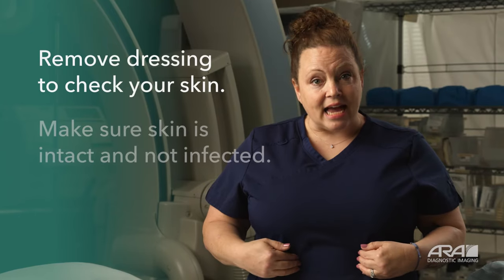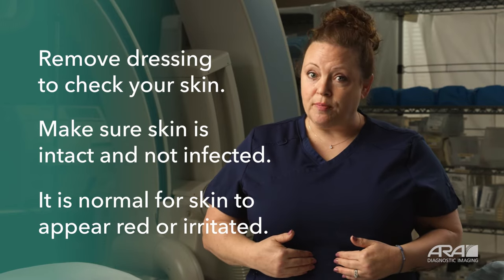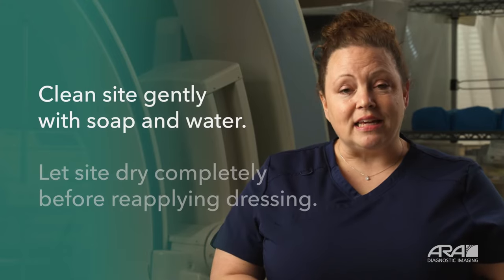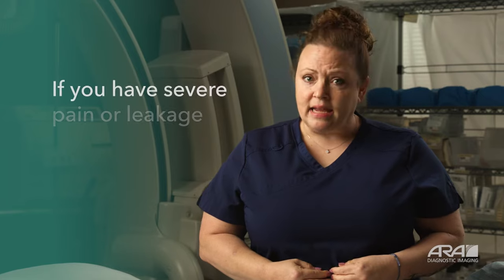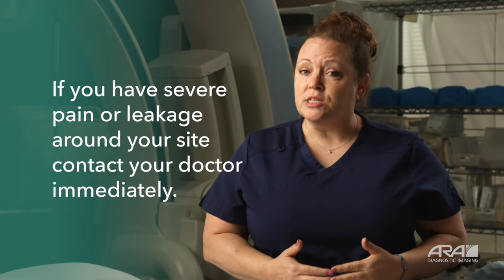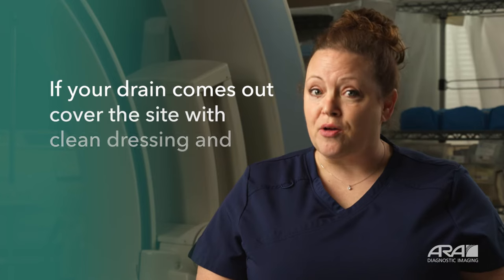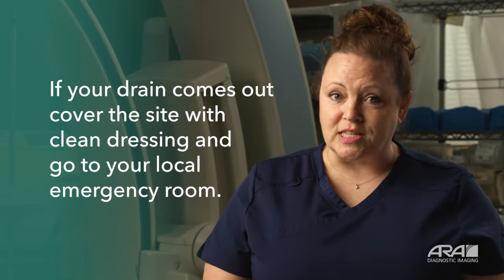When you remove your dressing, take a second and look at the skin underneath. Make sure your skin is intact. It's normal for it to appear a little abnormal. You may have to clean that site. Let the site dry completely before you recover and bandage your site. If you have severe pain or you notice leakage around the drain insertion site, please contact your doctor immediately. If for some reason your drain has come out, cover your drain with your bandaging materials and go to the local emergency department.